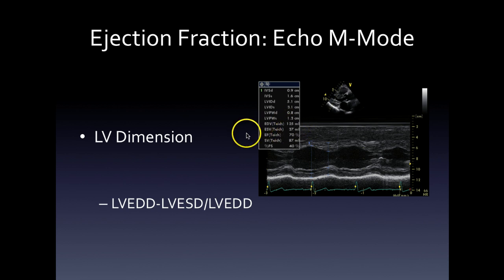Similarly, if you look here, the computer came up with a geometric assumption of 125 cc's. That's based on the normal shaped ventricle. It falls apart if you have a dilated ventricle, if you have an apical infarct. So these geometric and mathematical assumptions, generated to give an ejection fraction of 70%, don't hold up in the abnormal state, or in the older patient as well.